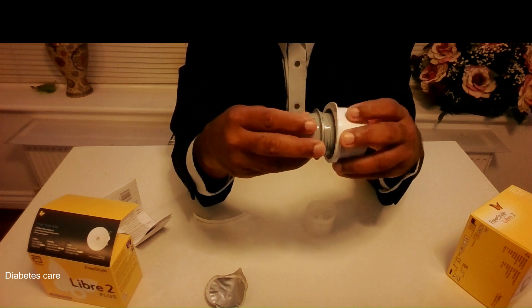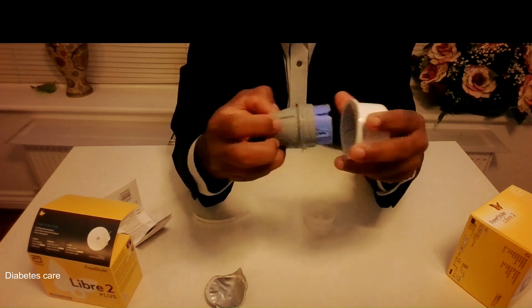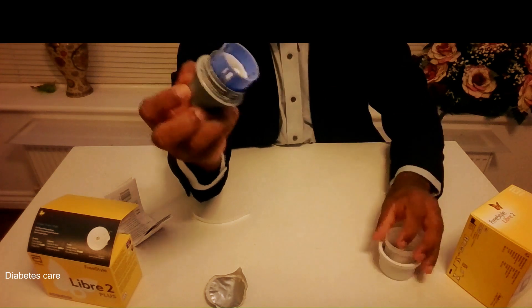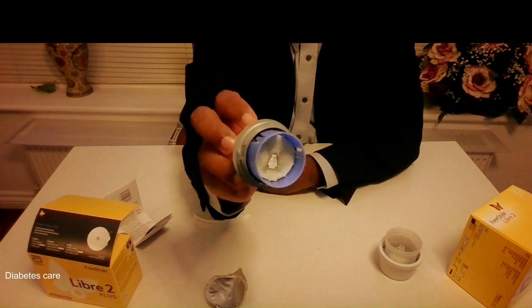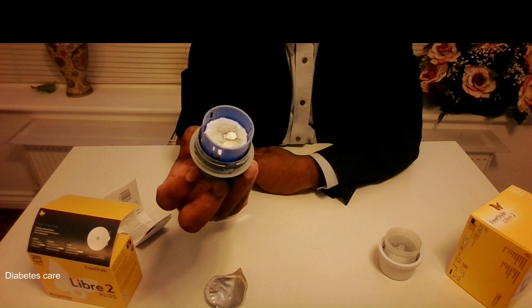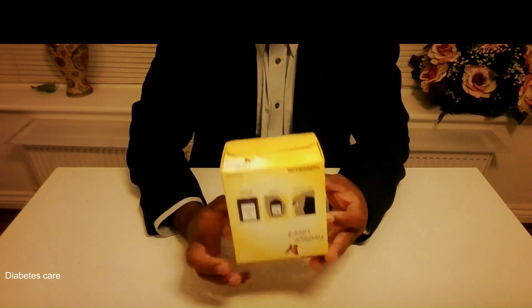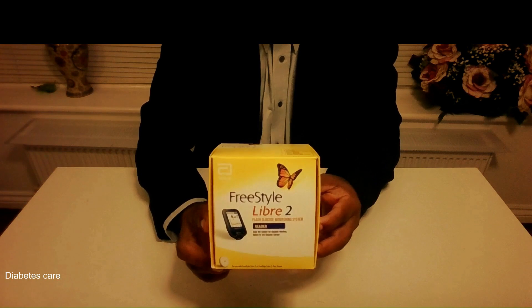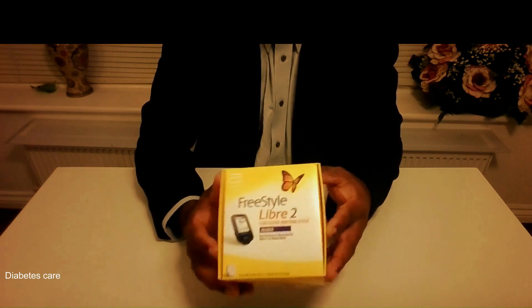Once you've done that, push it and remove the applicator. The applicator is now waste, and this is the sensor ready to apply. If you don't have the LibreLink app on your phone or your phone is not compatible, you can use the Libre reader to read your glucose readings — use it to scan.